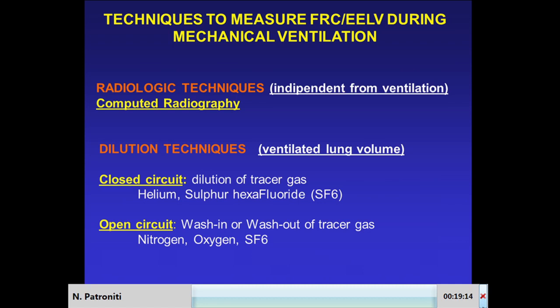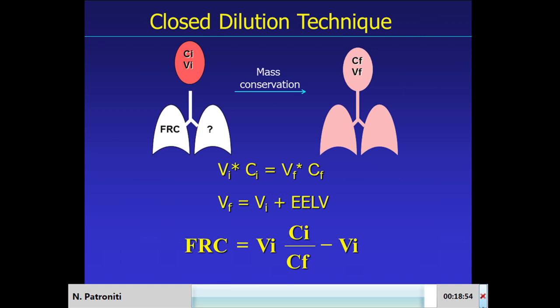There are many techniques to measure lung volumes. I will just talk about dilution techniques because other speakers will talk about imaging. Basically, we have two different ways to measure lung volume with dilution techniques, which is closed circuit and open circuit.